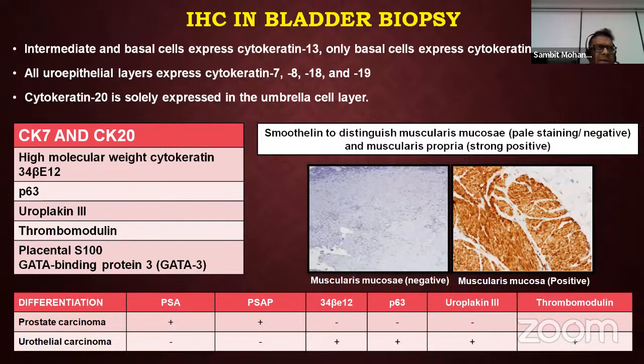The bladder tumors are usually pleomorphic. They show an extreme degree of pleomorphism, squamous metaplasia, and prominent nucleoli with marked variation in nuclear size. Bladder tumors are positive for GATA3 and uroplakin, whereas for high-grade prostate cancers, just remember one thing: they often lose prostate-specific antigen. They're usually PSA negative, but the best stain to pick up high-grade prostate cancer is NKX3.1.